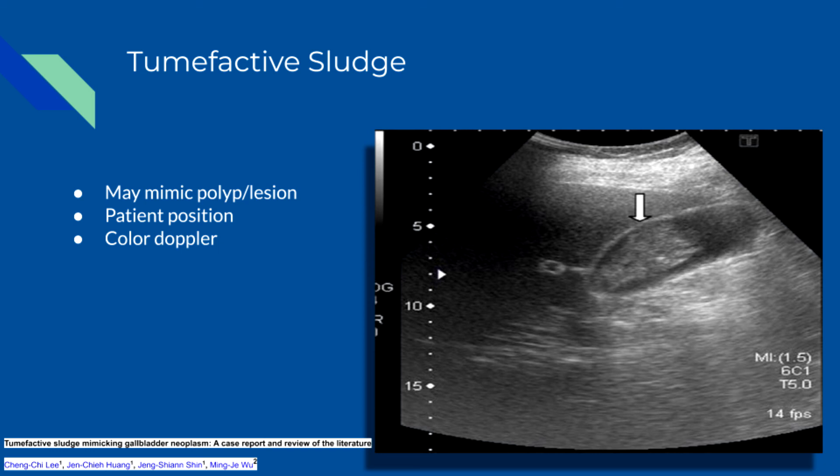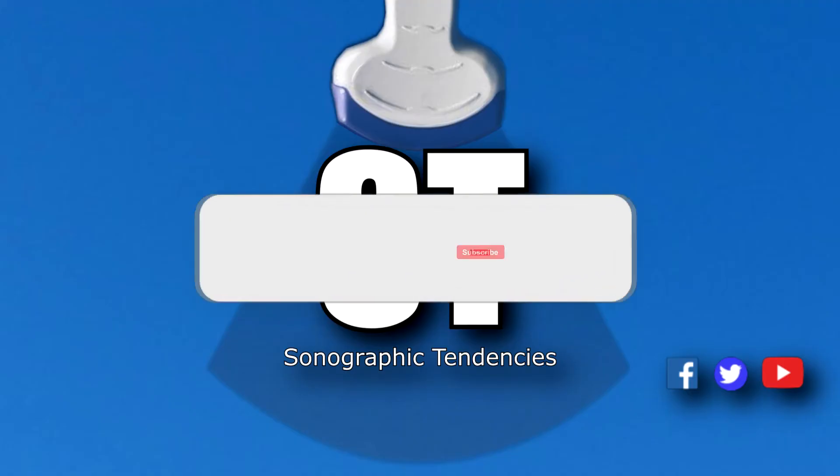The gallbladder may also be completely filled with sludge, making the whole gallbladder complex isoechoic to the liver. This is called hepatization.